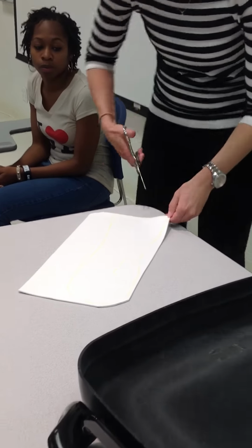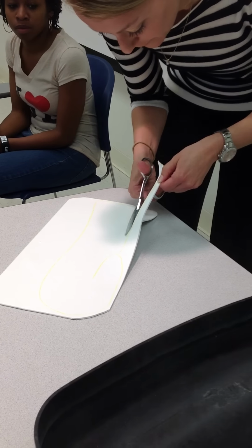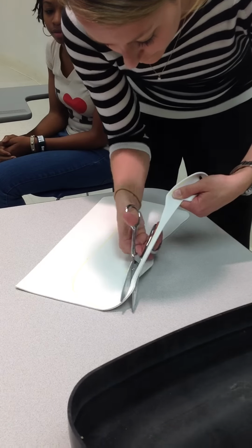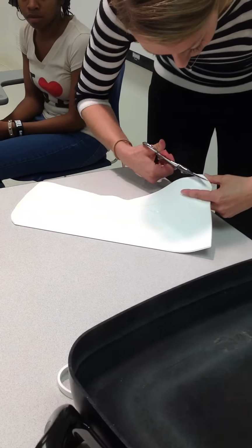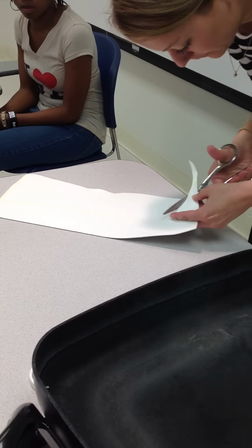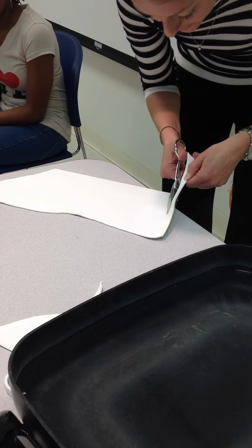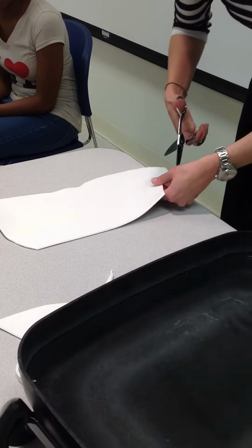Alright, so whenever I cut, I'm going to make sure I'm on the inside. I'm going to come back and do that portion. And then I'm done with that. And then I'm going to turn it. Now this keeps you from getting a lot of fingerprints on it. And it's not stretching out because I'm not having to hold it in the air. It's pretty much against the table. And I'm going to have to reheat this before.